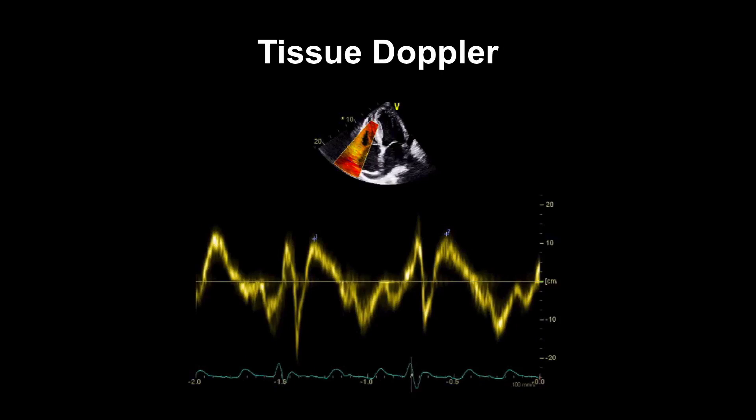The other way we can measure longitudinal function is to use tissue Doppler. It uses the same principle but measures the velocity of the myocardium at this point. We can see here that in systole — identified using the ECG — the velocity is above 10 centimetres per second, which is the cutoff for normality. Anything below 10 centimetres per second would suggest abnormal longitudinal function.